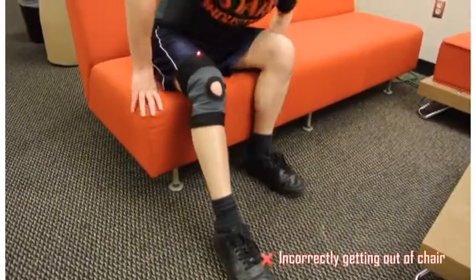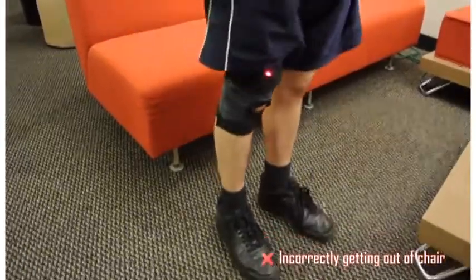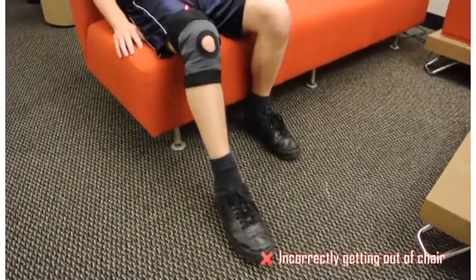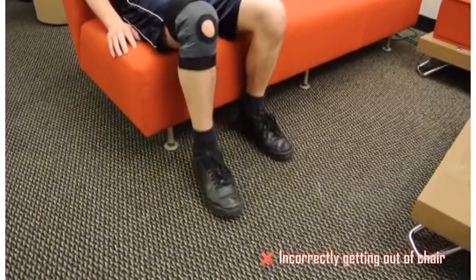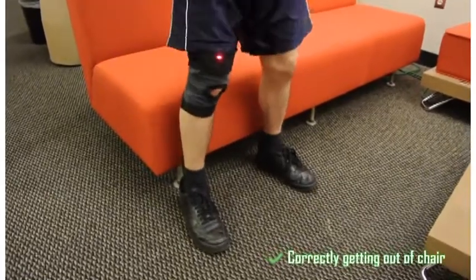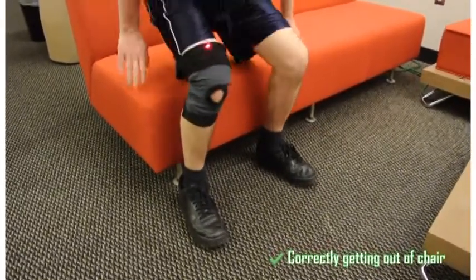The knee brace can also detect functional activities such as rising from a chair. Patients who struggle with getting out of a chair will often try to avoid bending their knees properly in order to avoid pain. The knee brace, on the other hand, will identify when the knees have been properly bent.